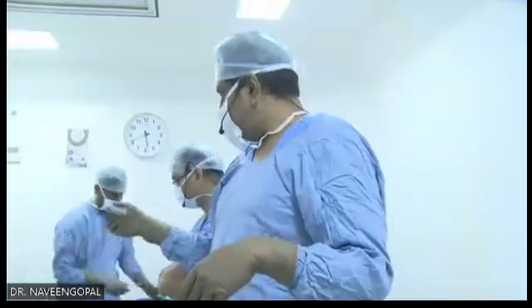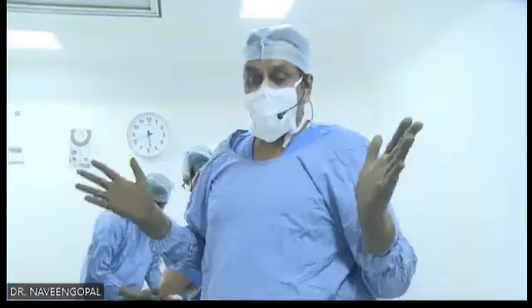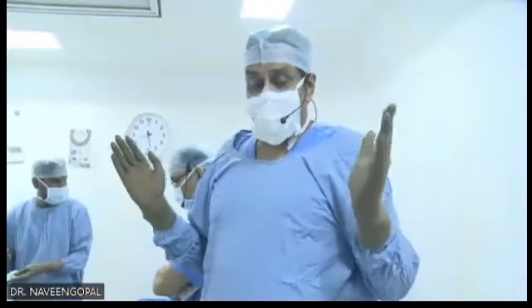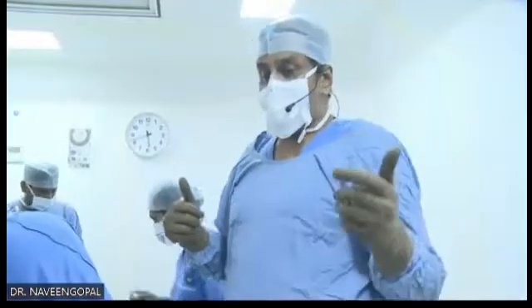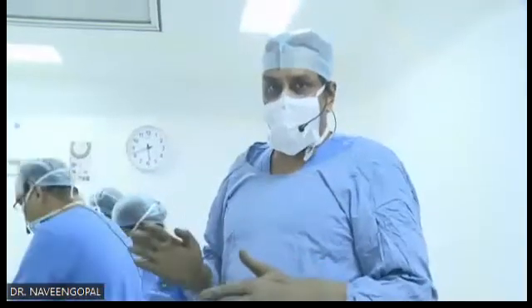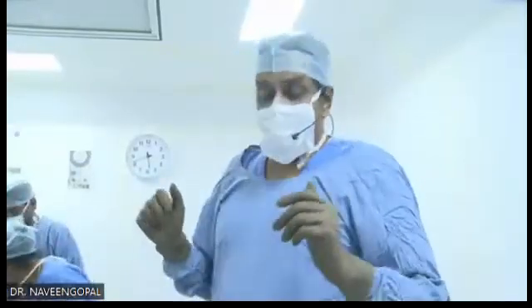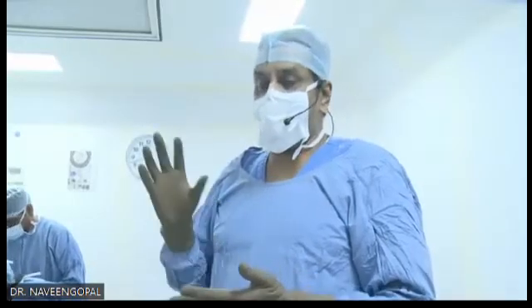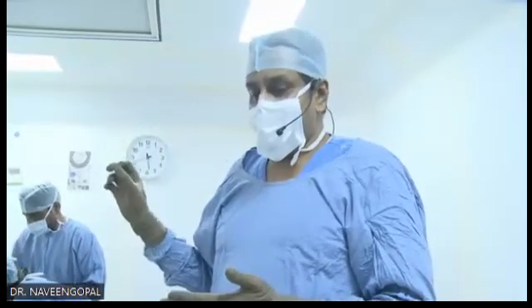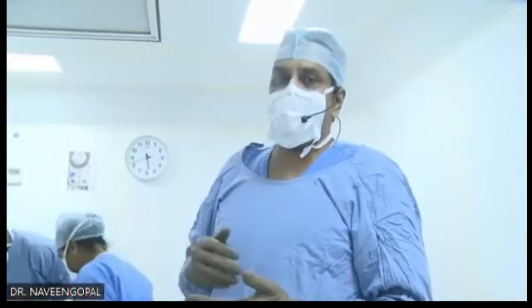I prefer to do a few things myself. First thing is refraction. Refraction is very important. First do the refraction, dilate the patient, see the retina, take the AR and do the PMT. I do the PMT myself on a phoropter. If you have a phoropter, it is fine, or else it's okay. Doesn't matter. Refraction is very important. Checking your white to white is very important because your sizing of the ICL depends on that, and your ACD is important because it determines your vault.